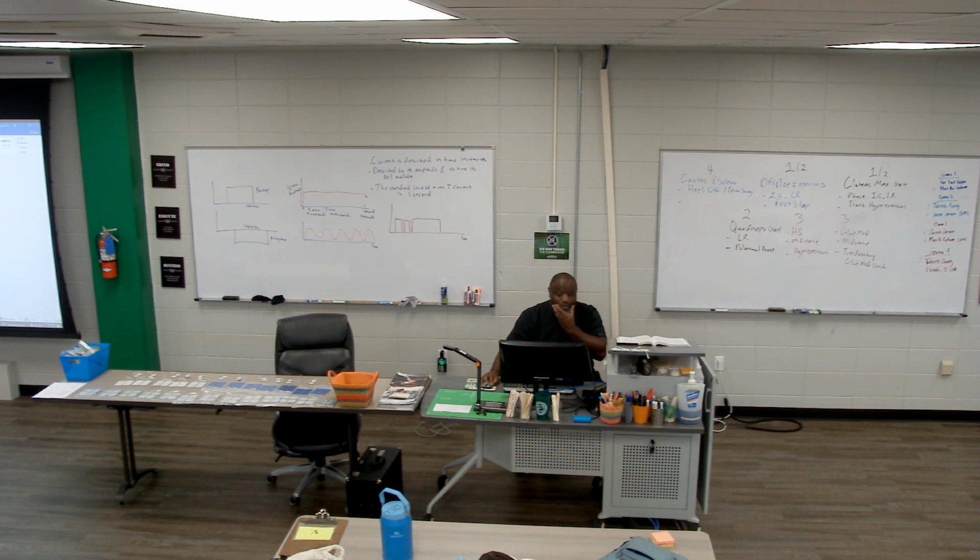Some of them will also offer what's called a monophasic current, a monophasic waveform. So it can be monophasic, it can be biphasic, symmetrical, asymmetrical, high volt, VMS, microcurrent.